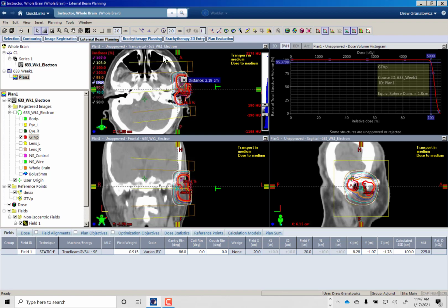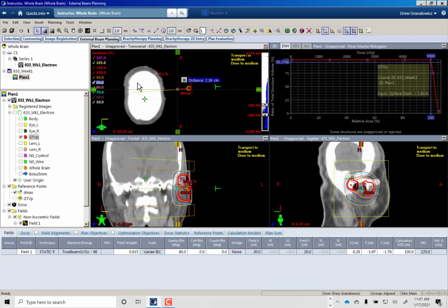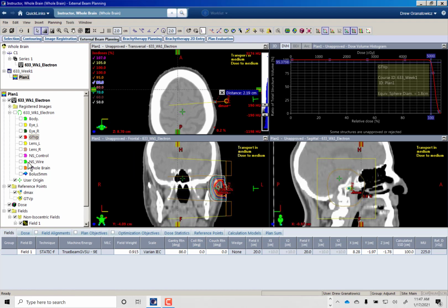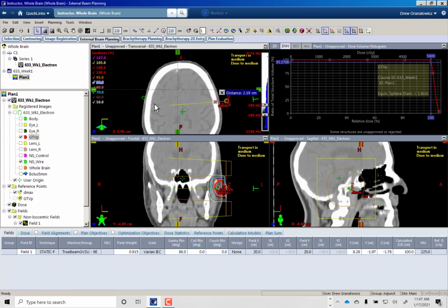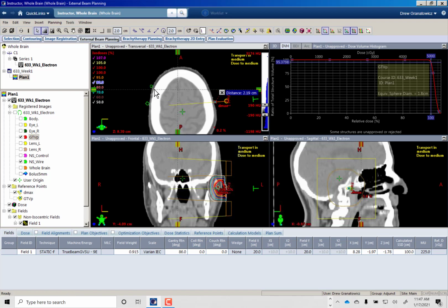But then the second plan I want you to do will be a lot simpler. Okay, and this is more towards a clinical setup. So we're going to pretend that in the sim, the doctor wired out this skin lesion that he wants to treat, and the wire represents the block margin, or where he wants the block edge to be.